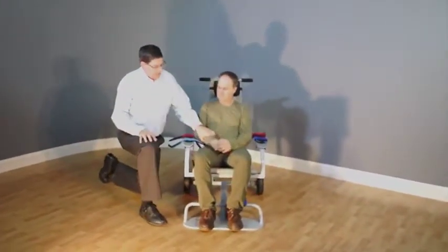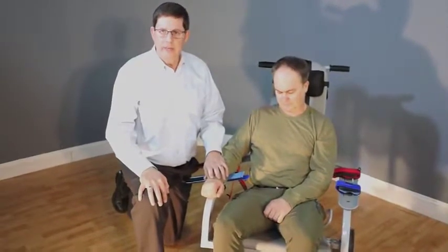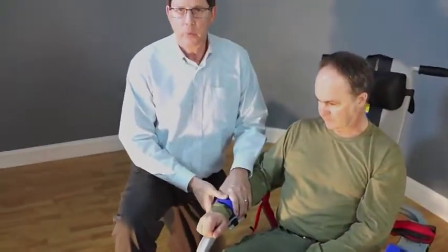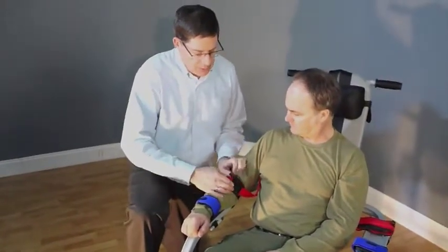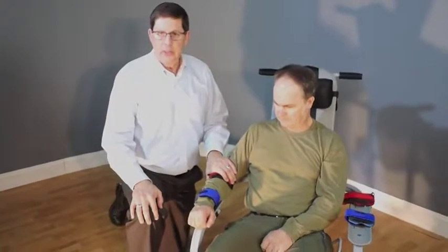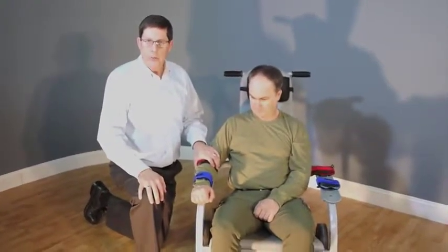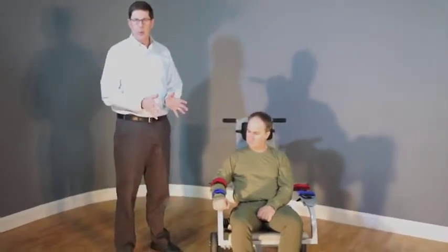When you put the arm on the armrest, the most important part is making sure the wrist and palm are flat against the armrest. Then take the open restraint, cross them over, and make sure it's nice and tight, keeping the wrist in place. Repeat the process for the other side — cross the straps over, each of the latches come across, and hold that in place. The elbow strap ensures detainees or patients cannot raise their elbow and get leverage against the wrist strap, which would enable them to get out of the arm restraint. This elbow strap keeps the arm in place and reduces pressure on the wrist strap.